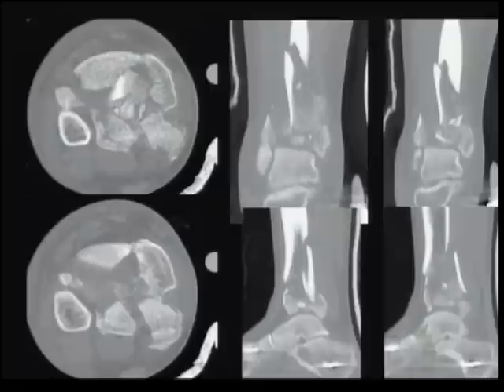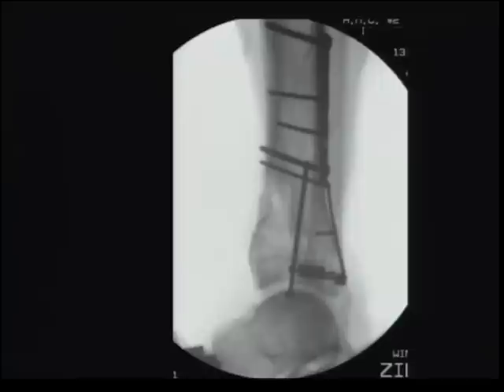I remember this case from several years ago as though it were yesterday. I called Dave Beret and said, I think we need to work on this one together, and he was good enough to come down. This one's so ugly, so we began really from the back, first reconstructing the cortical segment and then working down to the articular segment so that there would be a stable pillar to fix to. And so once again, a posteromedial exposure, which allows wide access to the posterior aspect of the pilon, and then using some flexible fixation.